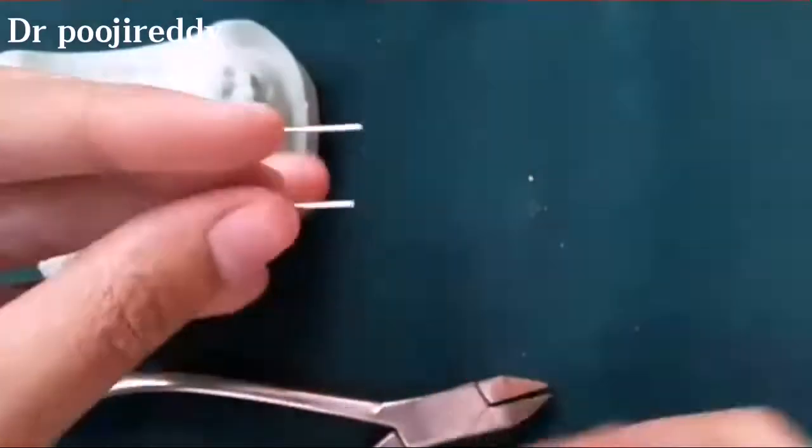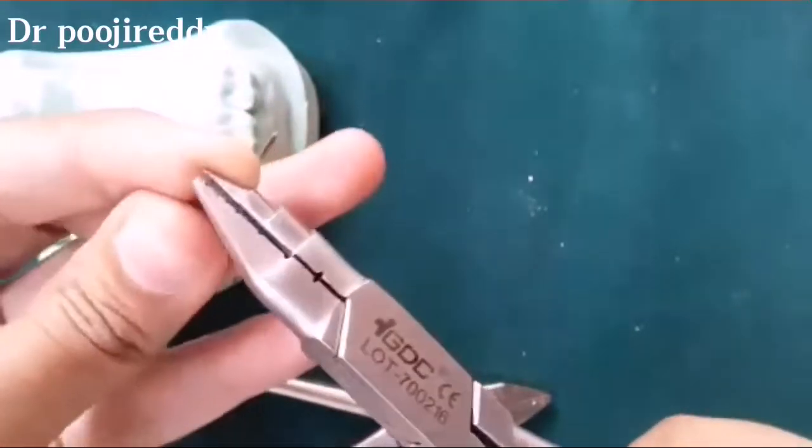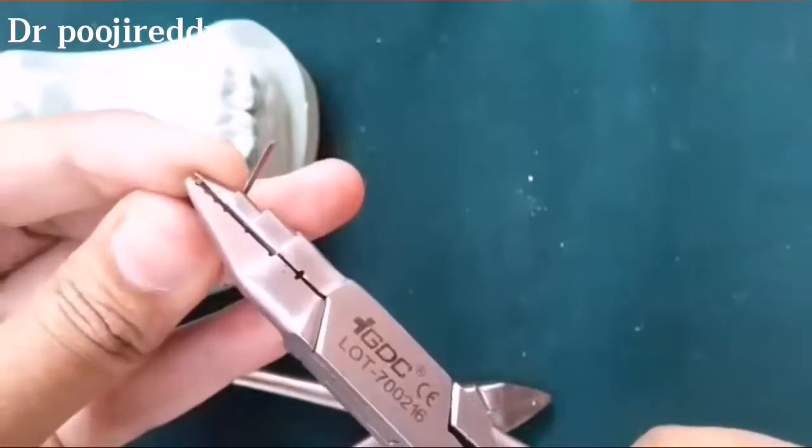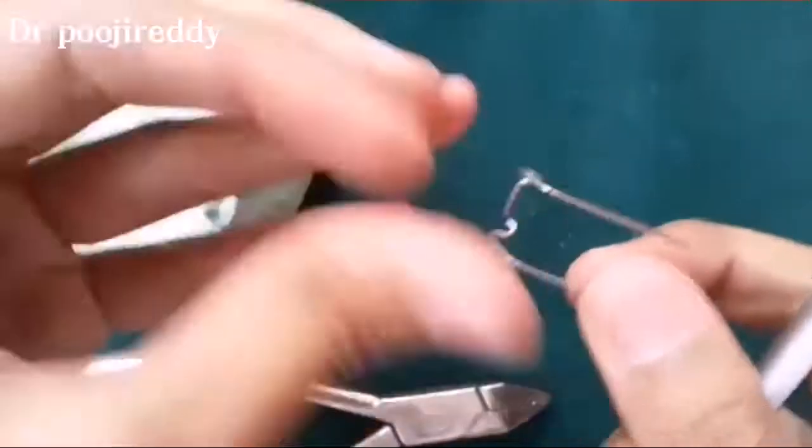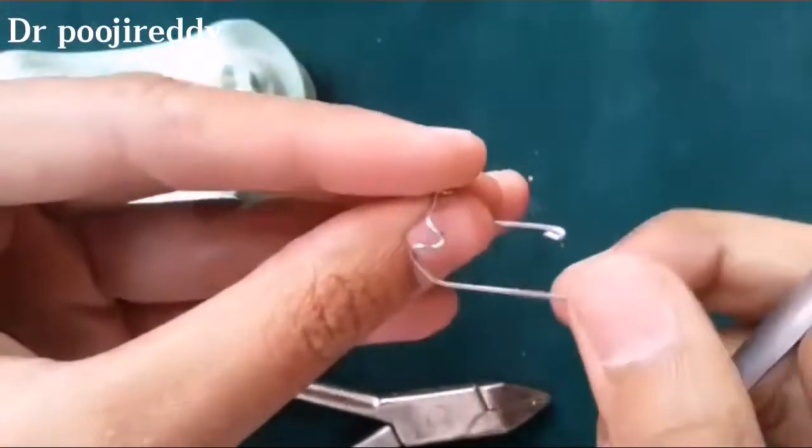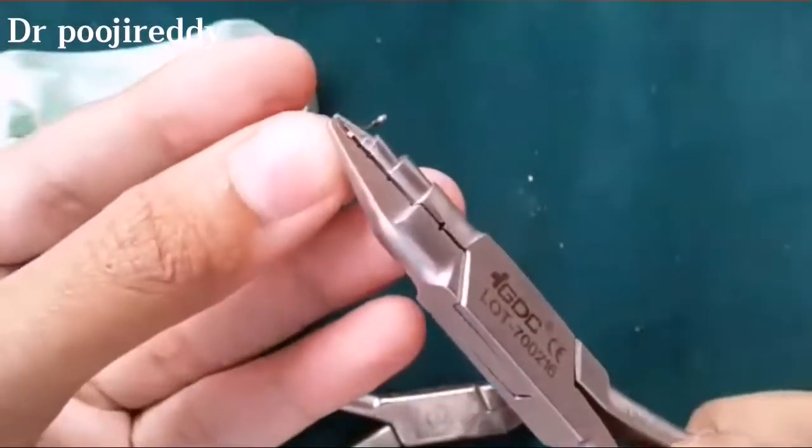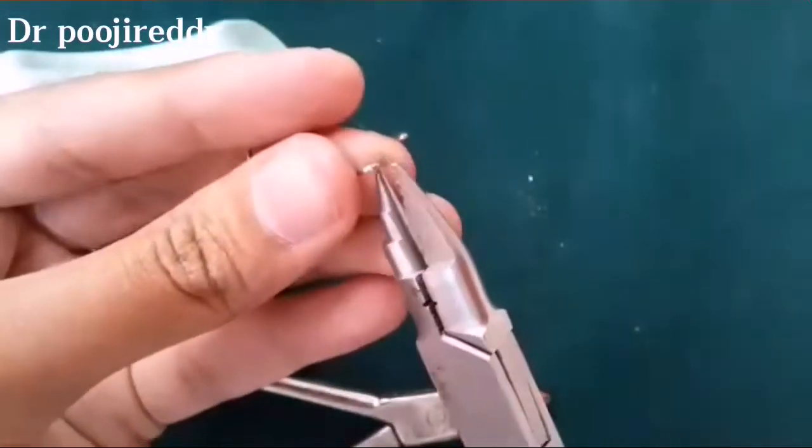And after the proper adaptation of the tag arm and the Adams clasp to the cast, start closing the retentive arm's tip. Close in the retentive arm tip so that it doesn't hurt the hard tissue or palate. Usually the retentive arm or tag arm goes into acrylic when we are fabricating any removable appliance.